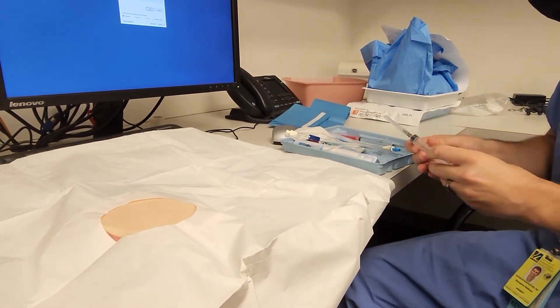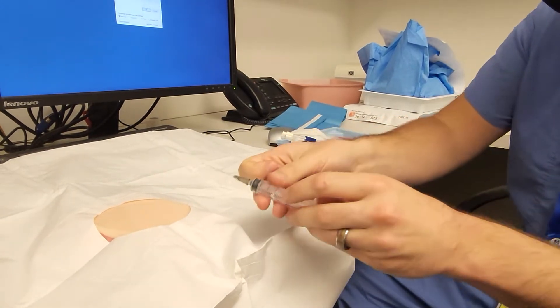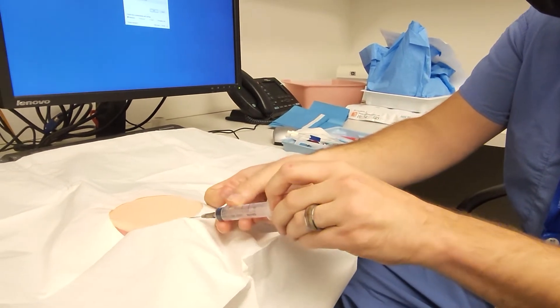If there's time, you can use lidocaine to numb up the area.